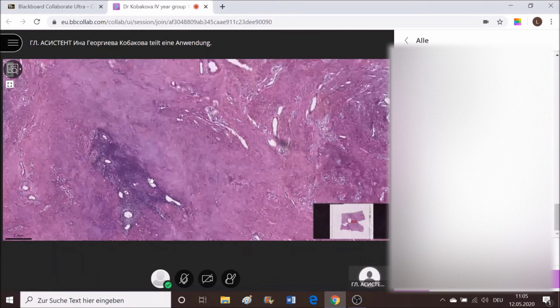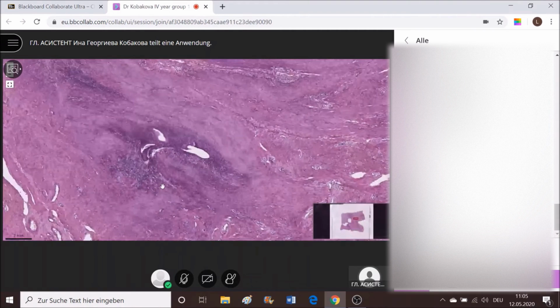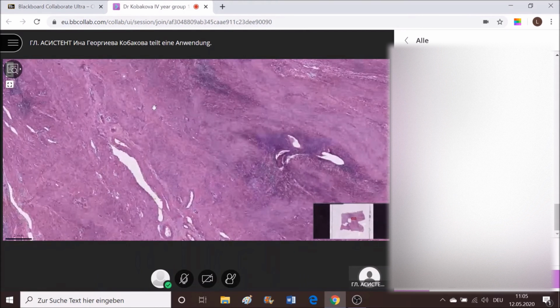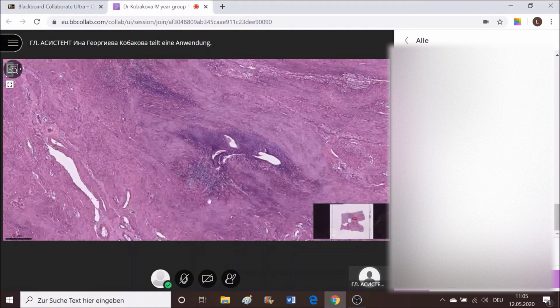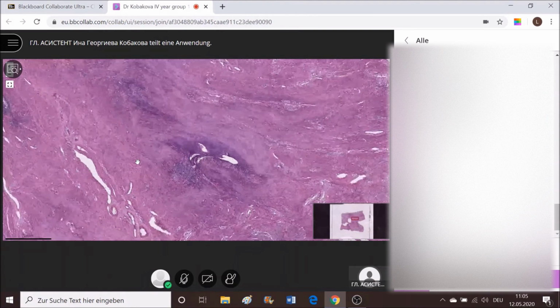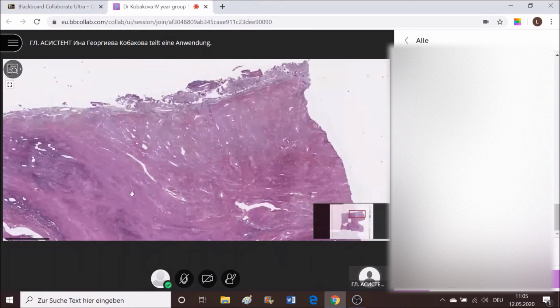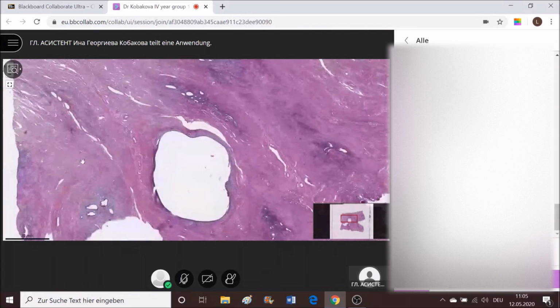We don't see much of hemosiderin deposits here, latents here, if you will, but what we saw clearly were the glandular structures and the stromal elements around these, in between the smooth muscle cells. So this process is a good example, and this picture is a good example of adenomyosis.